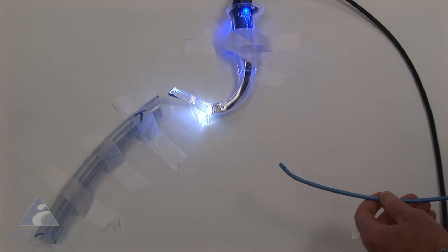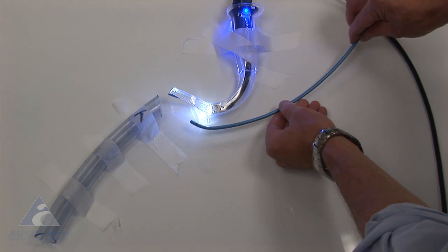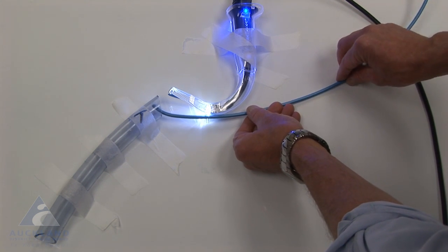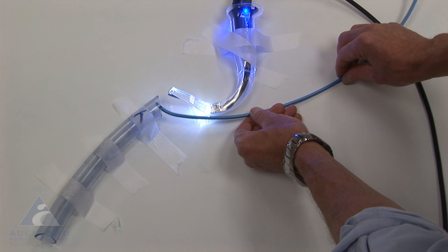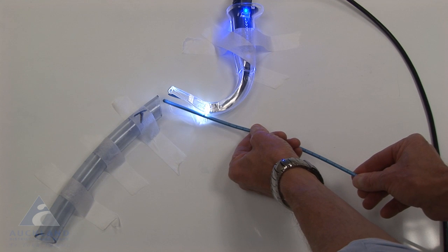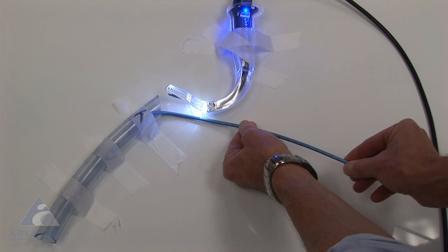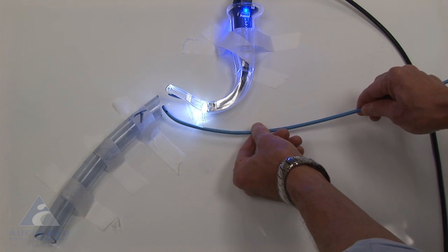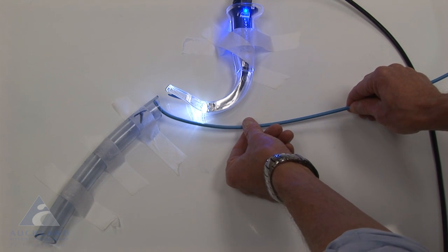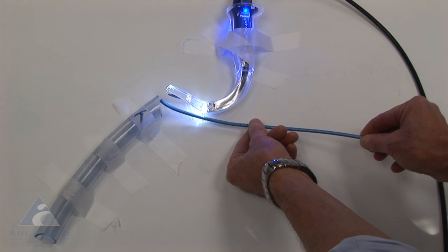The next item I wish to show is what happens with a gum elastic bougie when you are able to get it to come around and impact the anterior tracheal wall. The tip of this bougie will in fact not go posteriorly down the trachea. If you try to spin the bougie to go in this sort of direction, it can flick out, as I've just done there, rather than to actually go down to the tracheal lumen. So the bougie, which normally is a great friend to us with difficult intubations, impacts the anterior tracheal wall and has the same problems as the tube. It has too much friction, and when you spin it, in this case, it dislodges.